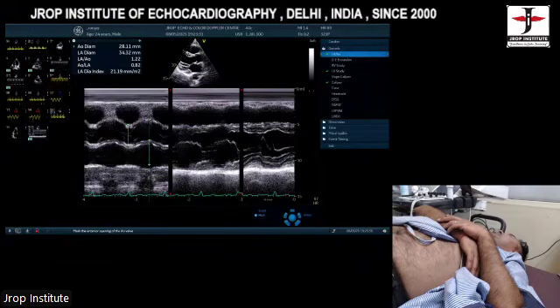Okay, thank you, sir. Dr. Chandrakant? Hi, good evening, sir. Good evening, Chandrakant. I want to know once again, sir, pulmonary artery pressure, how to measure. Okay.